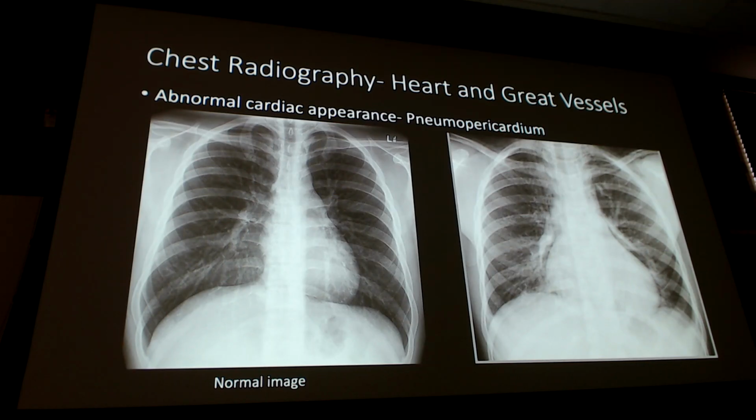Again, that quality is kind of iffy when you get to the upper part of the lungs where I'm looking. I definitely don't have any pleural effusions. I got no blunting of my costophrenic angles right now that I can tell, so I would just call this just a straight pneumopericardium. Where's my great vessels? About right here. I got the air below.